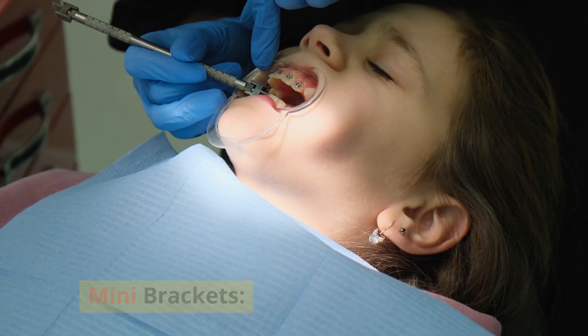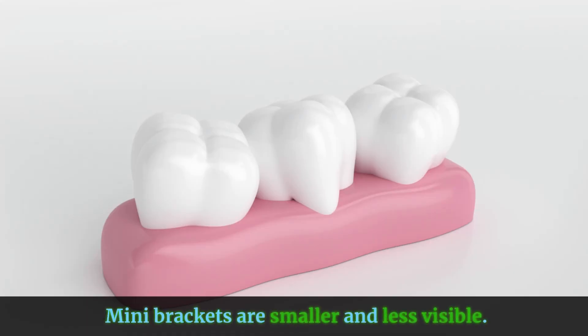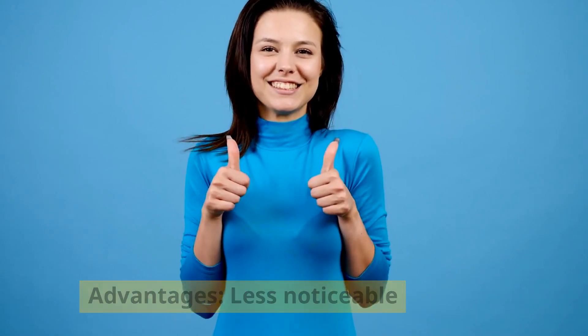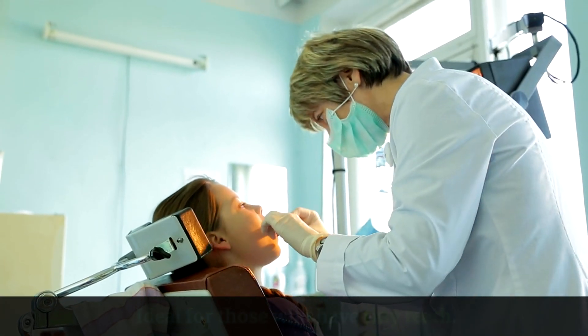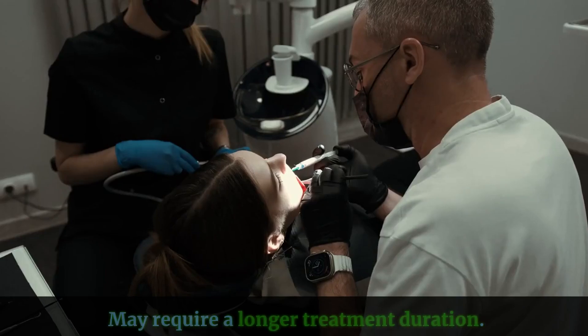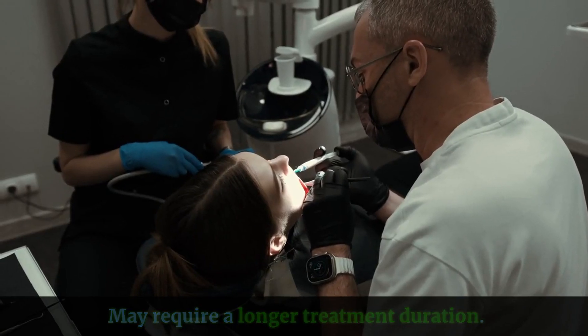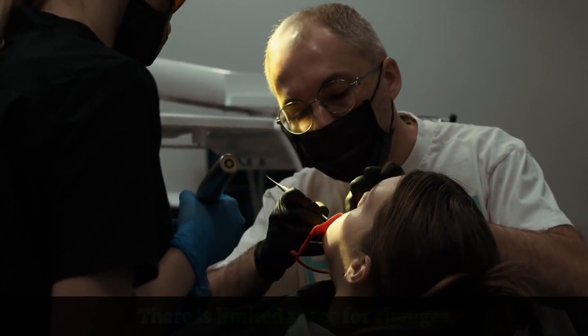Mini brackets are smaller and less visible. Advantages: less noticeable and ideal for those who have tiny teeth. Disadvantages: may require a longer treatment duration and there is limited space for adjustments.